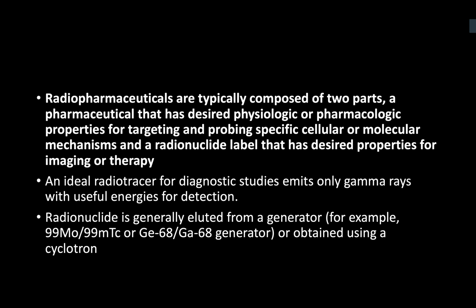Okay, so what happens when you combine technetium, which is used in several other scenarios as well, specifically for bone scan, is that it becomes a radiopharmaceutical. The MDP will be taken up by the areas of high bone metabolism, and the technetium will tag along with the MDP. Once it is trapped in the cells, it will emit the gamma rays that are taken up by the gamma cameras situated outside the patient. Do you know how the radionuclide is generated?